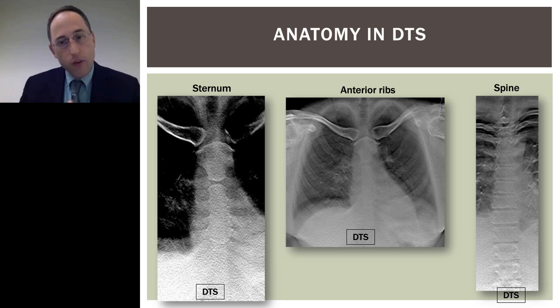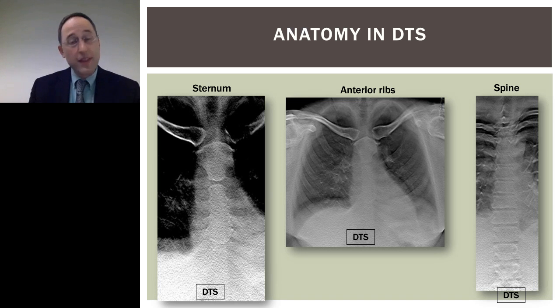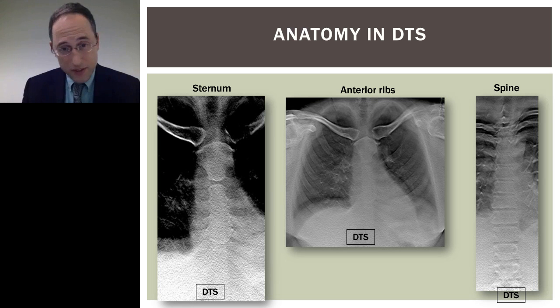All right, so for bony structures, I have a slide here. On the left hand slide, the focus plane has been set to that of the sternum, and you can see the sternum and the anterior ribs nicely laid out. And when you think about it, when have you ever seen the anterior ribs at the positions where they're actually articulating with the sternum? You just don't see that in radiography. But you can see them here plainly on the tomosynthesis image.